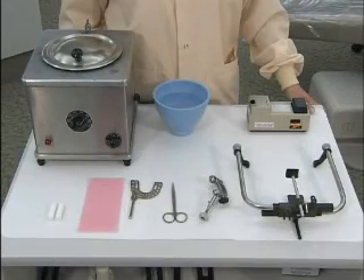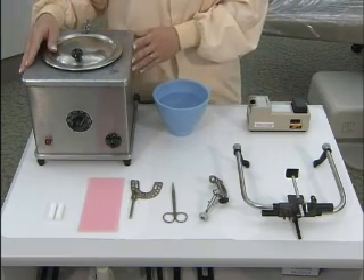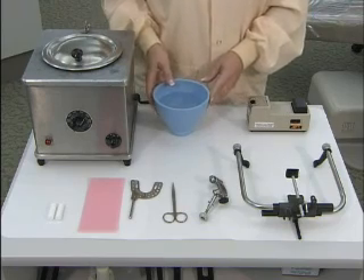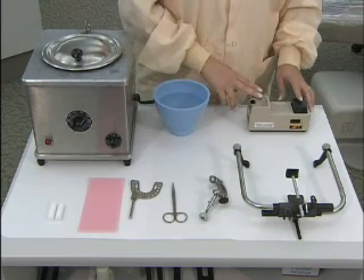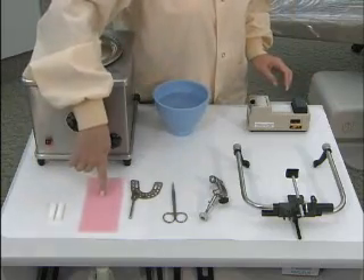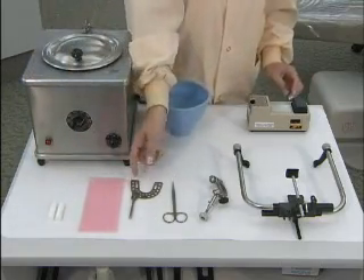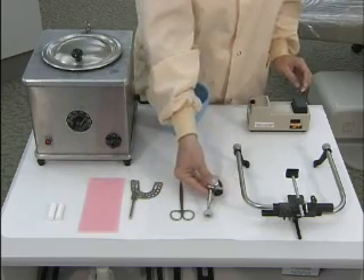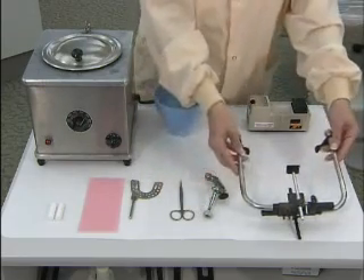Here's the armamentarium for the face bow record. First, you'll need a heat source — use a hot water bath or a bowl of hot water, or an alcohol burner. You're also going to need cotton rolls, base plate wax, a bite fork, scissors, the joint piece for the face bow, and a face bow.